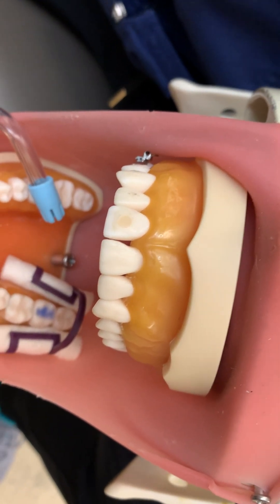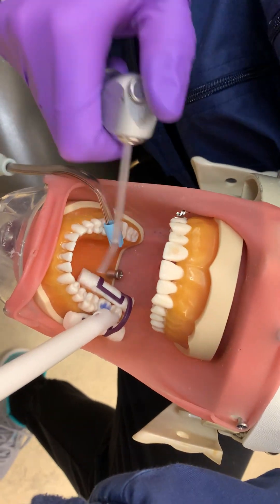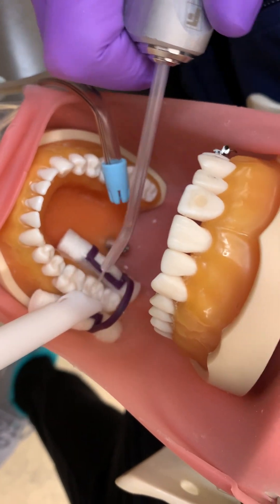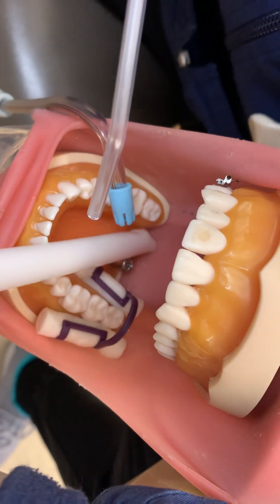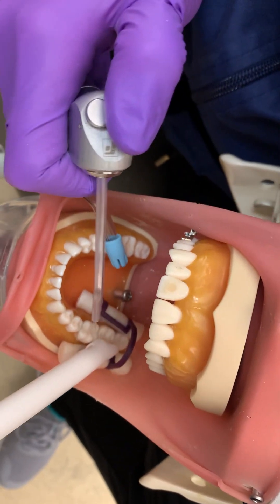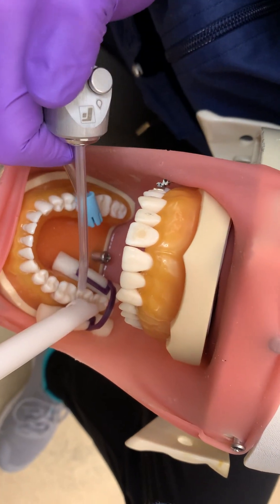She is then going to use her high-volume evacuator to rinse the area. You don't want etch getting on the client's tissues, on her tongue, or teeth. She has her suction tip very close to the area of all of her teeth.